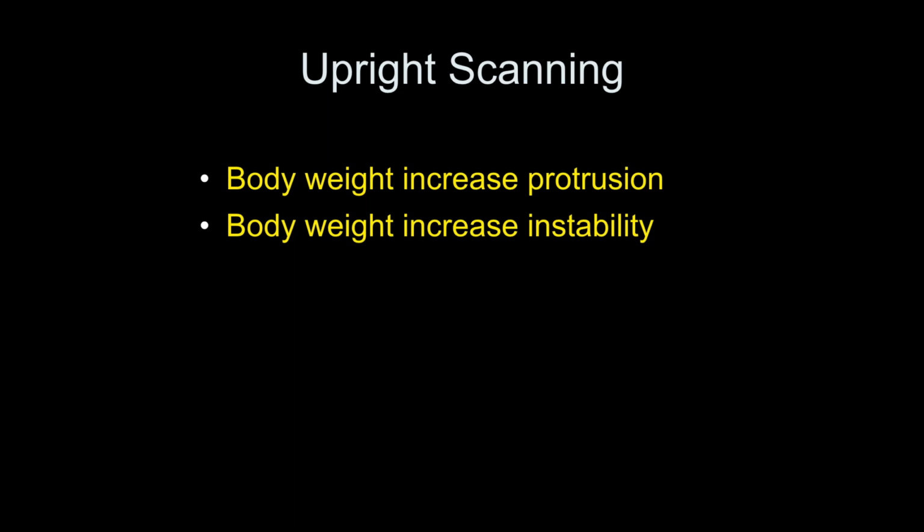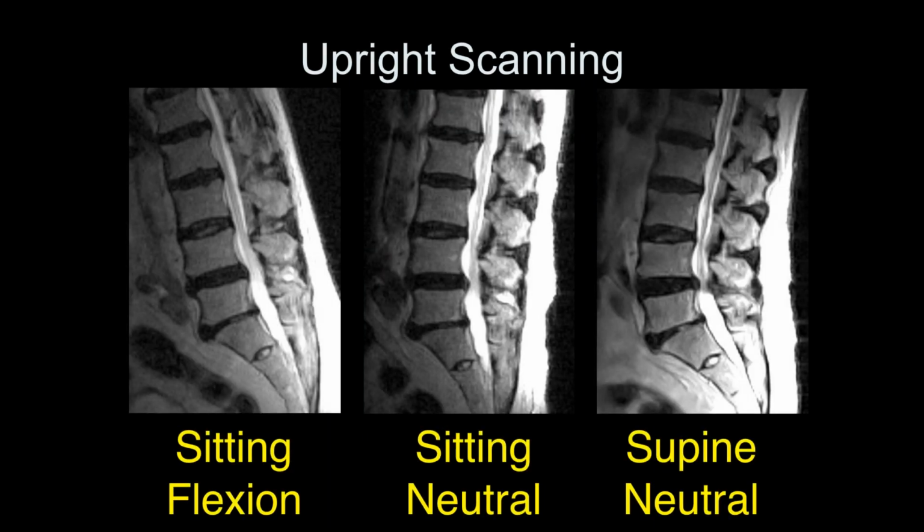So we did a series of studies. First one was 50 patients where we did upright scanning. In this case, this upright was actually sitting because we got too much motion if they just stood up.